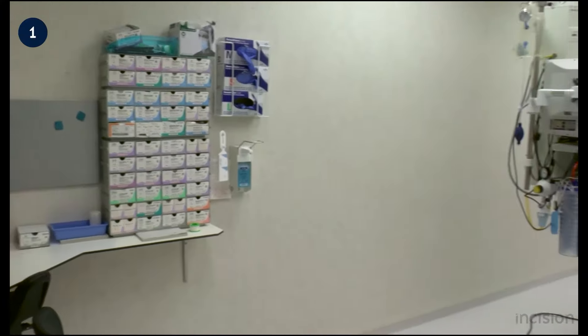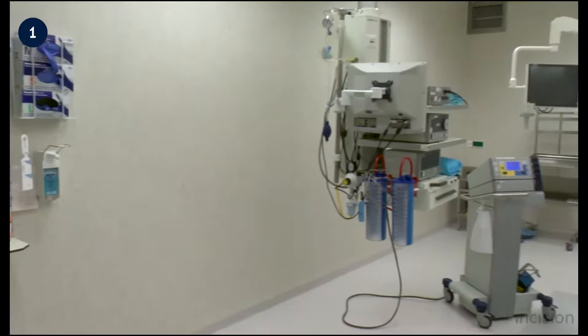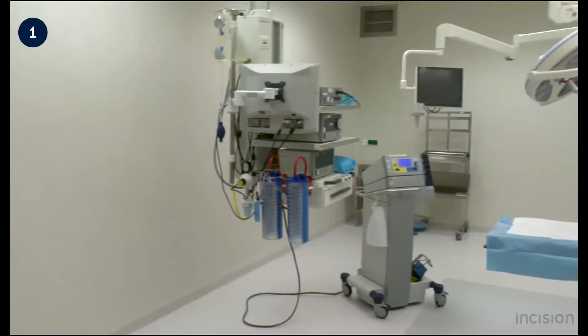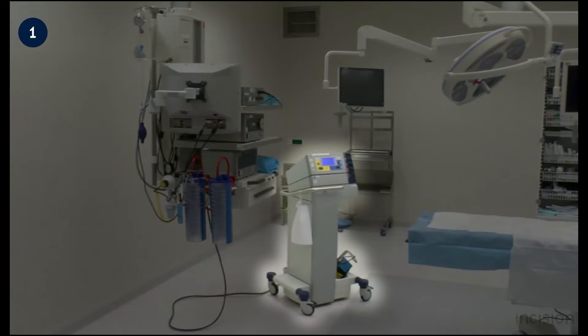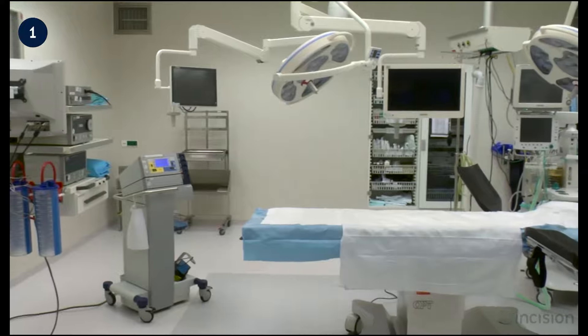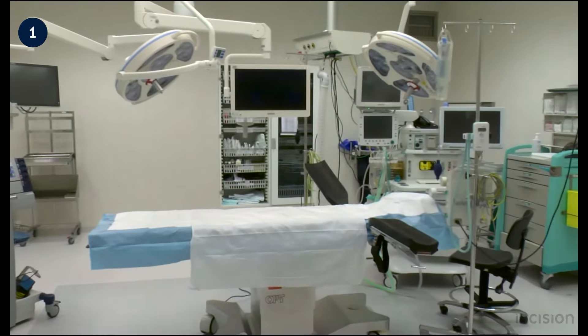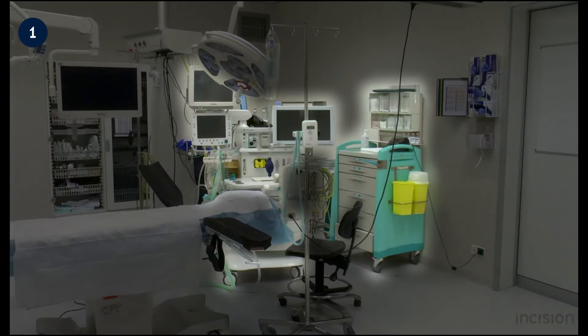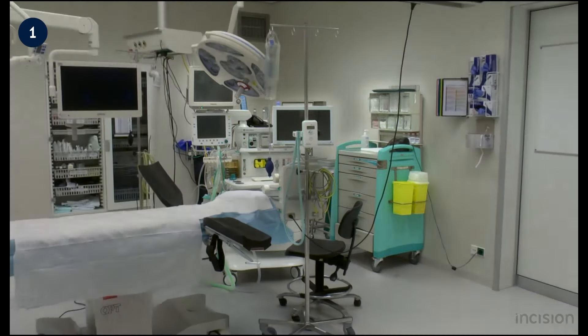Each operation room should contain suction and, if necessary, laparoscopic equipment, diathermy equipment, and an operation table. Normally the surgeon stands on the right side, the assistant and scrub nurse on the left side. The anaesthesiologist stands on the head side with his equipment.